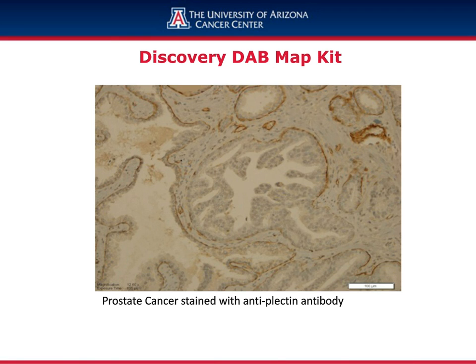Here is an example of prostate cancer with a very low-expressing antibody, plectin, which is an integrin molecule needed for invasion of prostate cancer further into the prostate gland.